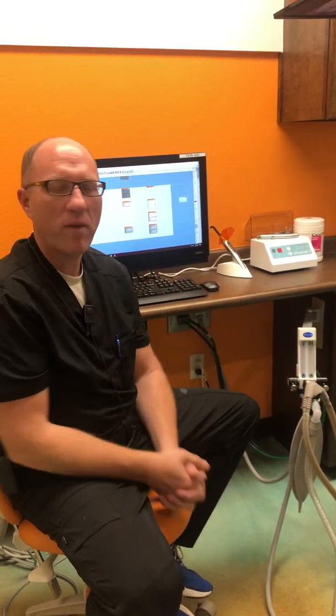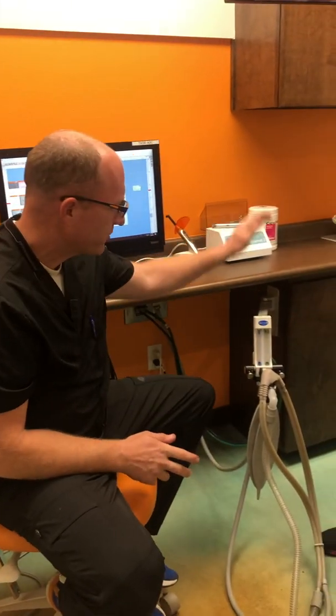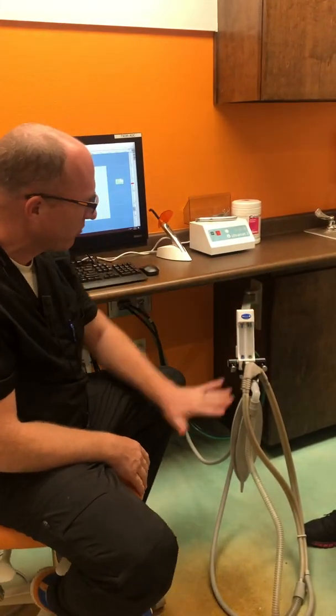We're going to take a few minutes and talk about how our nitrous flow meter works and how to give proper nitrous with our equipment. We're going to do a little review of what the nitrous flow meter is, which is this little contraption we have right here.